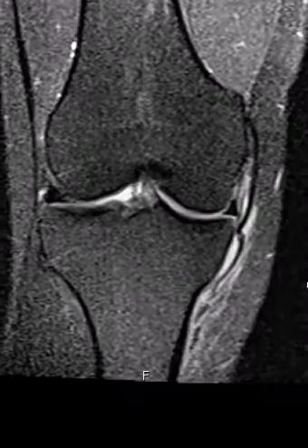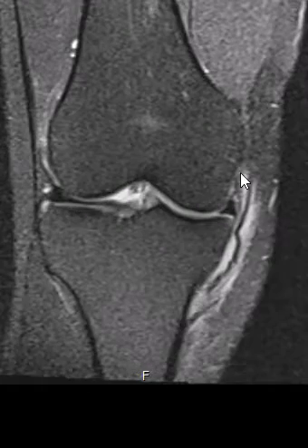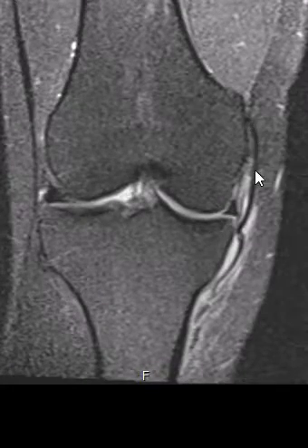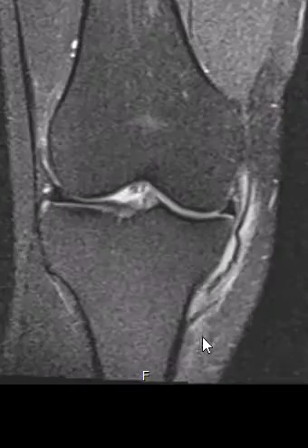In the same patient we see the same thing here, but this is a different sequence where anything abnormal is bright. You can see this brightness outlining the medial collateral ligament tear. Here's the medial collateral ligament coming down, looping around, and ending right there — that's the edge of it.